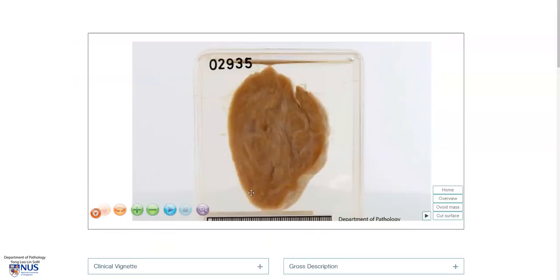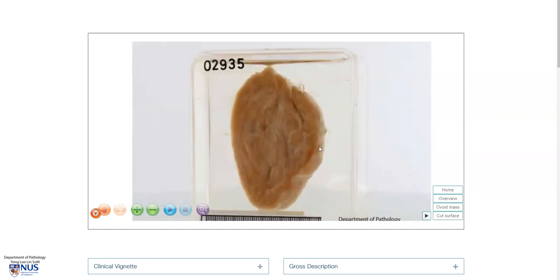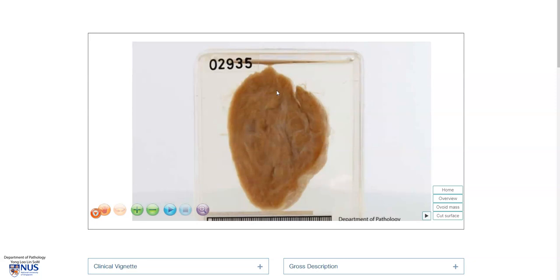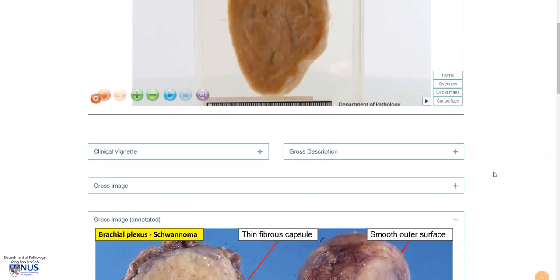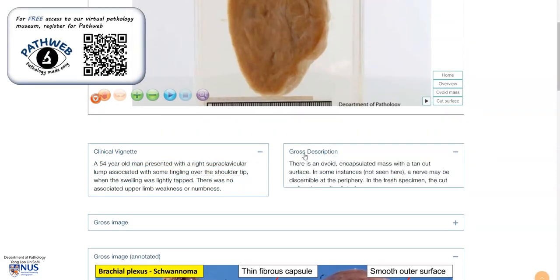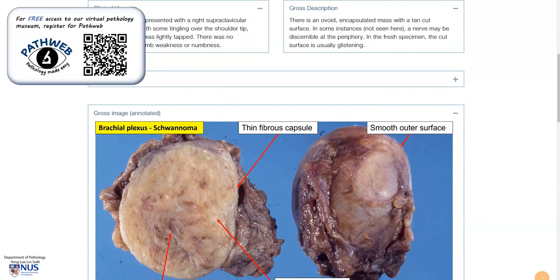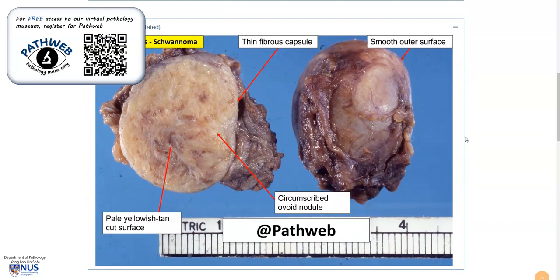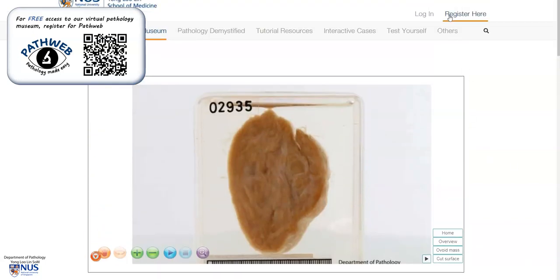In summary, this is a schwannoma. It is a benign nerve sheath tumor that arises from Schwann cells. It is well-circumscribed and sometimes encapsulated, as you can see here, with a glistening cut surface that may appear pale, tan, yellowish, or whitish. This is taken from PathWeb, and just to show you some examples of additional information, including annotated gross and microscopic pictures. Registration is free, and the link is in the video description.